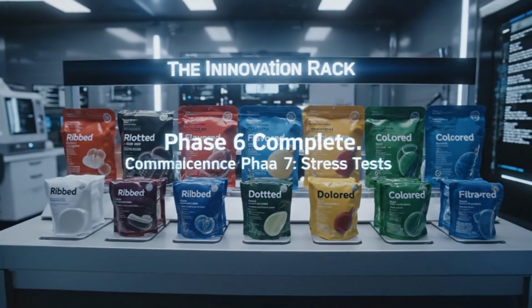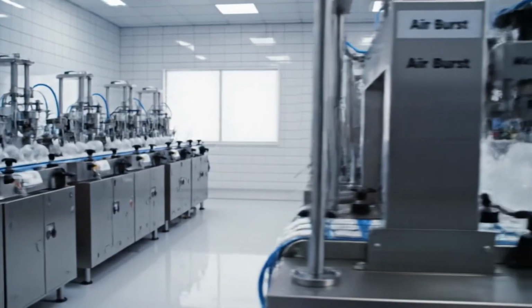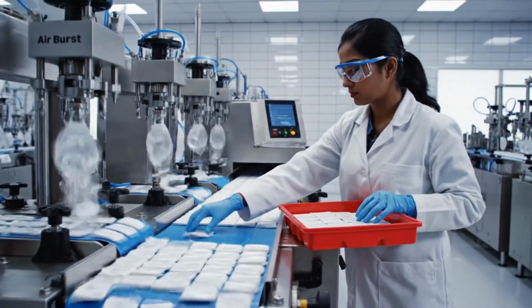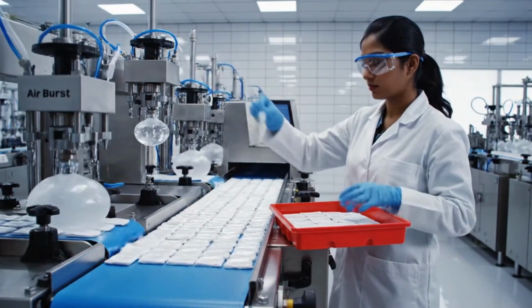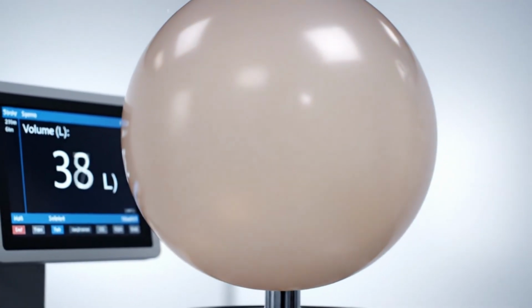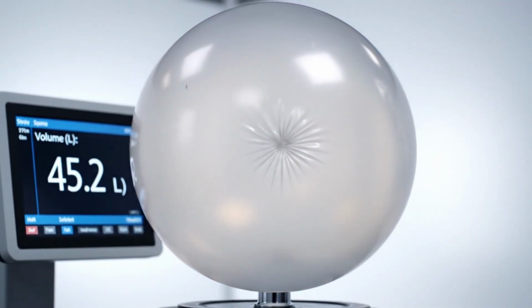Now, it's time to push them to the breaking point. We don't just hope our condoms are strong. We prove it in a laboratory designed for extreme failure. The airburst test is the ultimate measure of elasticity. A standard condom must hold at least 18 liters.